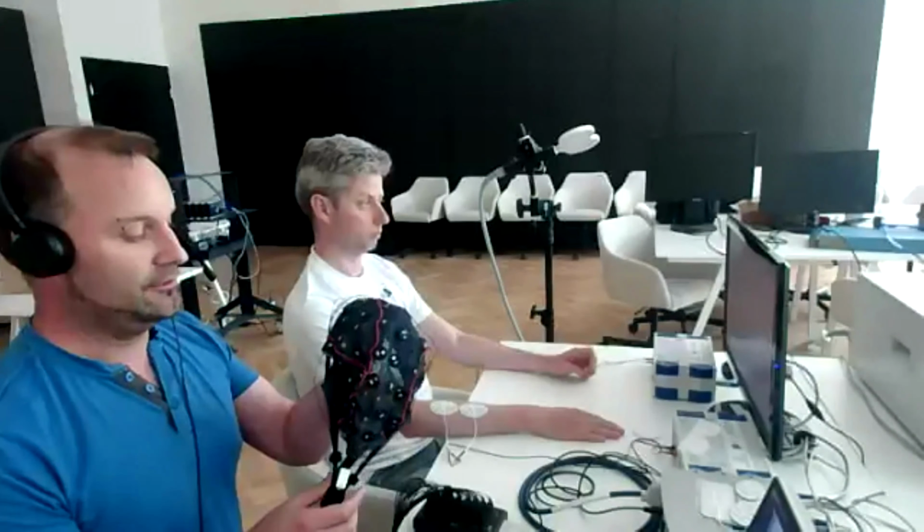So we put on the cap. We check for the positioning. And then we take our syringe, and like my colleagues also showed yesterday, one by one, we put gel there.